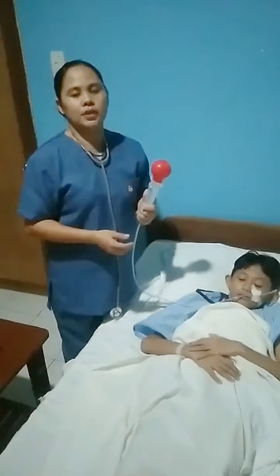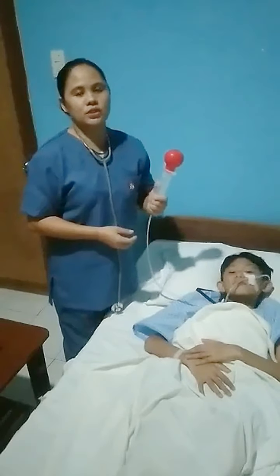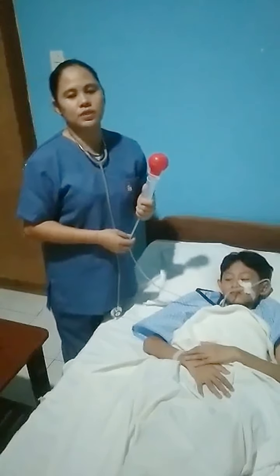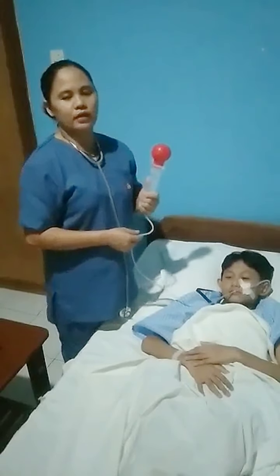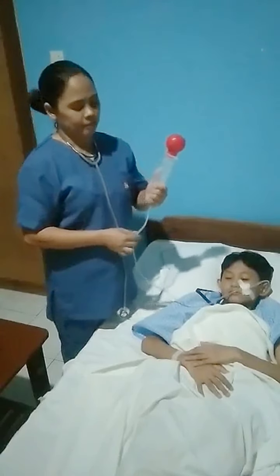After checking the whooshing sound, we can now aspirate for residual volume. To aspirate for residual volume, we have to remember to kink the tube. And since the syringe is already here, no need to remove it. Just remove the cover, press to create a suction effect, and then let go of the kink and measure the residual volume.